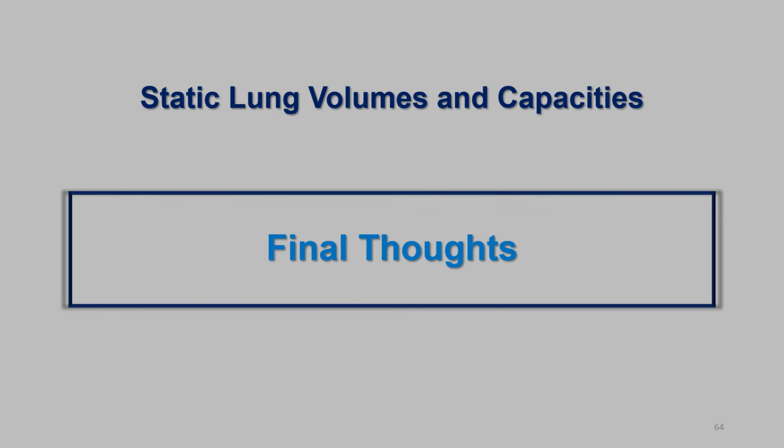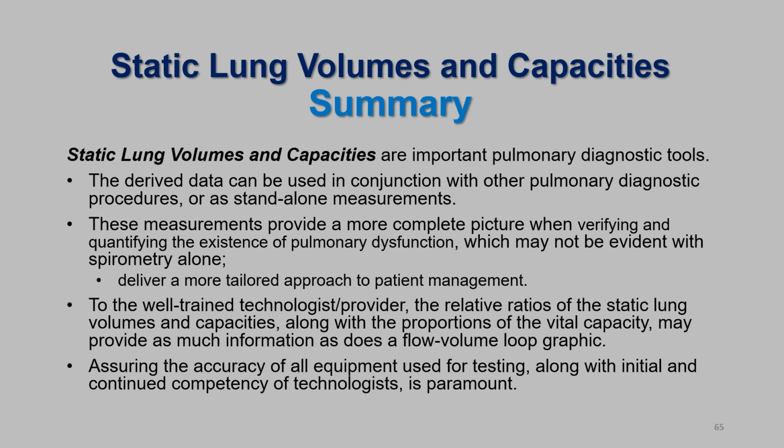Okay, here are some final thoughts regarding static lung volumes and capacities. Measurement of static lung volumes and capacities remains an important tool to verify and quantify the existence of pulmonary dysfunction. The utility of these measurements, however, is dependent on the knowledge and skills of the technologist, who must ensure that the equipment is operating in an acceptable fashion, as well as ensuring that the subject is performing the tests as directed.